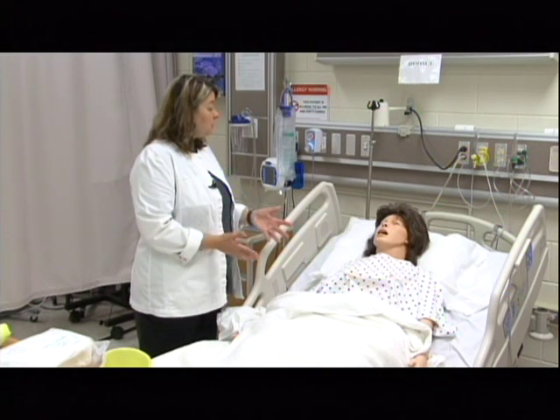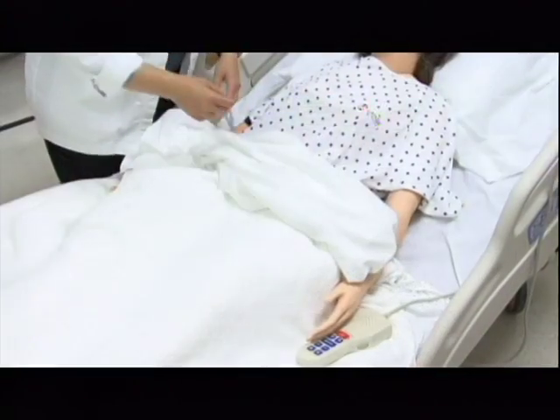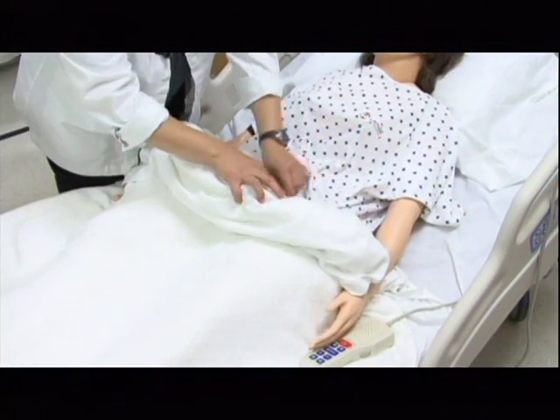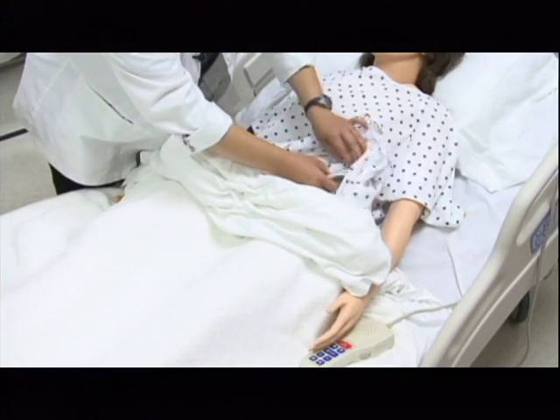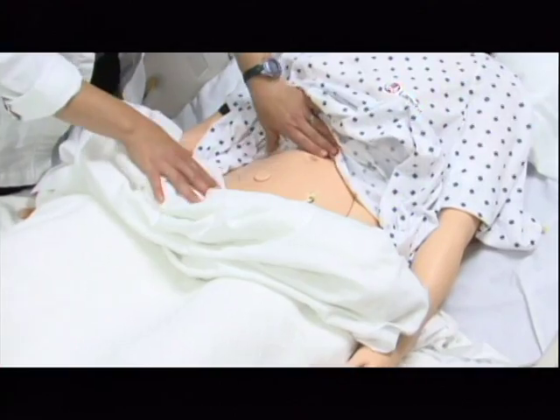Miss Smith, I'm now going to uncover you and we're going to move down and take a look at your tube. Is that okay? Okay, so Miss Smith, I'm going to go ahead and pull the covers down and uncover your stomach. Certainly I'm going to provide for privacy here and only uncover the tube in any areas that I need to be able to assess.